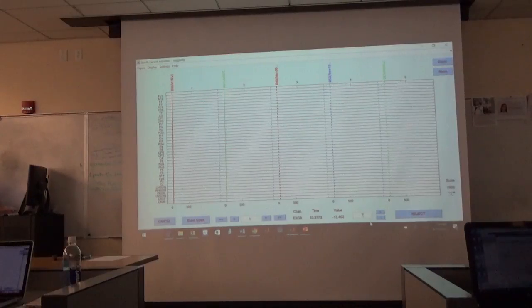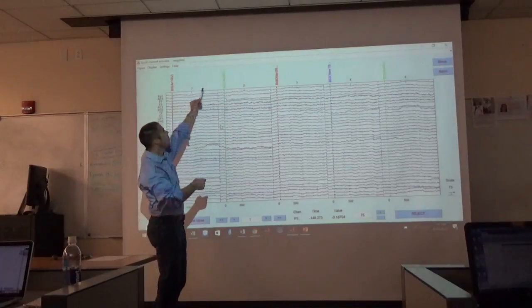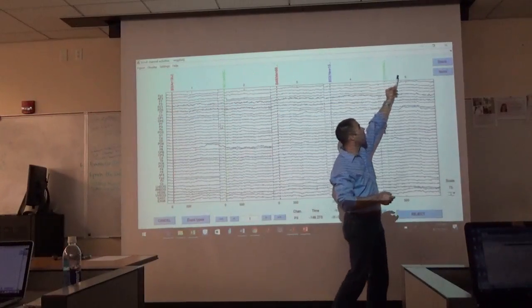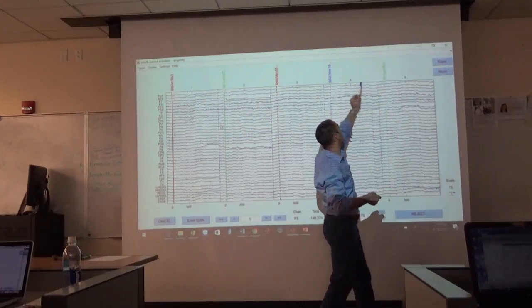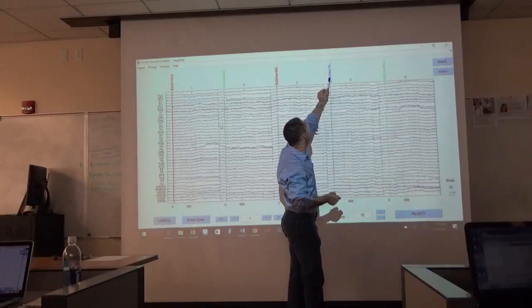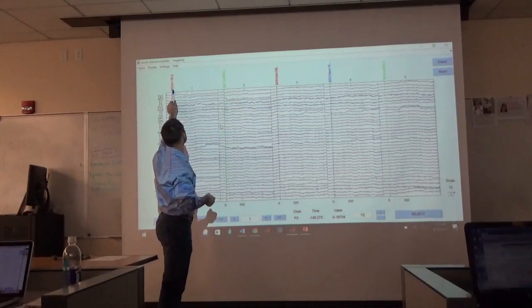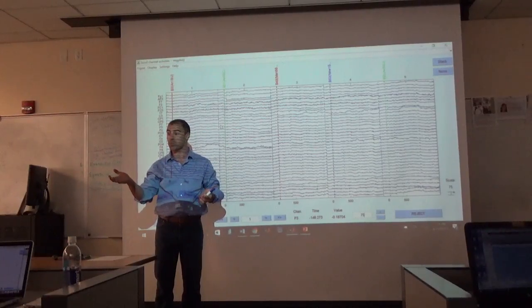Okay. So, when you do this, let's look at what you can do. Because we epoched the data, let's stick with our one in the middle here. So first of all, let's orient. We have trial 1, trial 2, trial 3, trial 4, trial 5. This tells you what it was. It was bin 23, bin 53, bin 48, bin 21, and bin 3. Now remember we added those numbers to our bins when we did events list, remember?